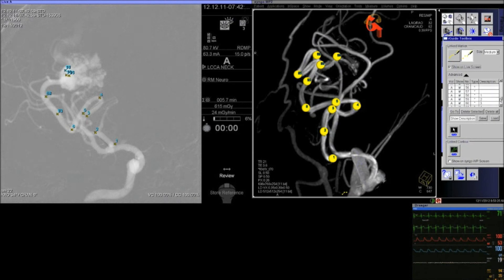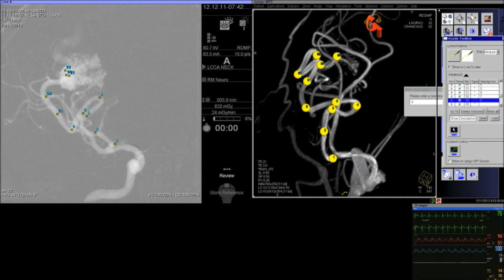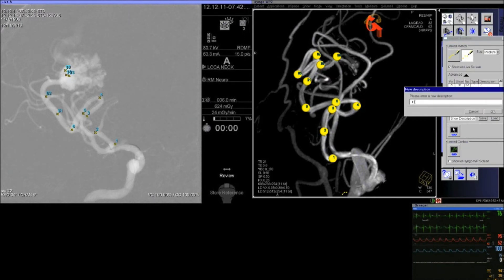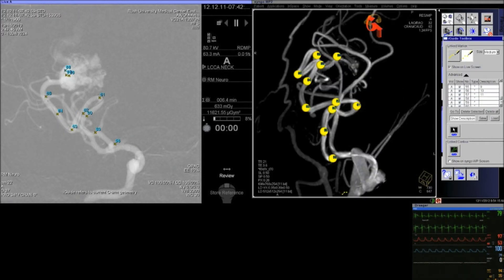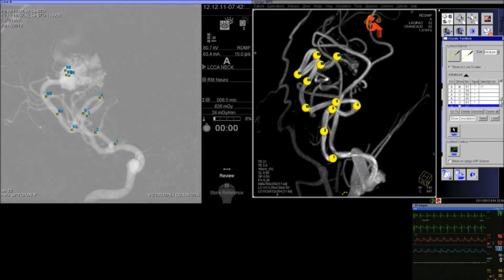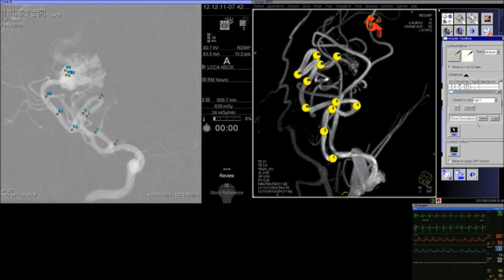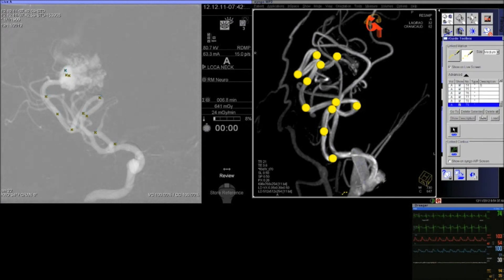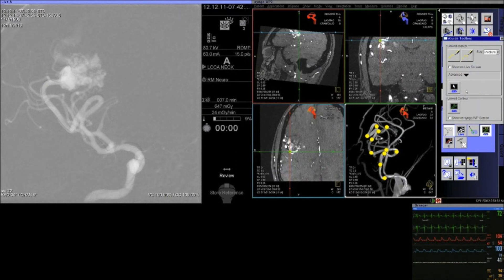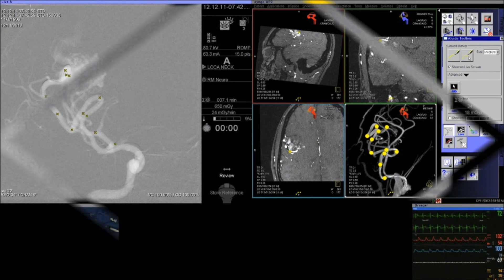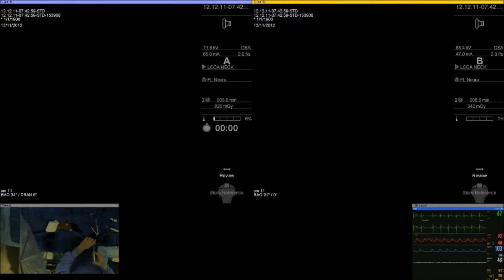Sometimes, if this is not easy to do, the microcatheter goes in the wrong path, so you redirect. In these cases, we may have to change and use a Synchro 10 microwire to add a bit more ability to redirect the catheter and find your path. Using a combination of flow guidance — pulling the microwire back and allowing the microcatheter to go forward on flow alone — and wire assistance with the Mirage and Synchro 10, I try to get as deep a position as I can into the nidus.